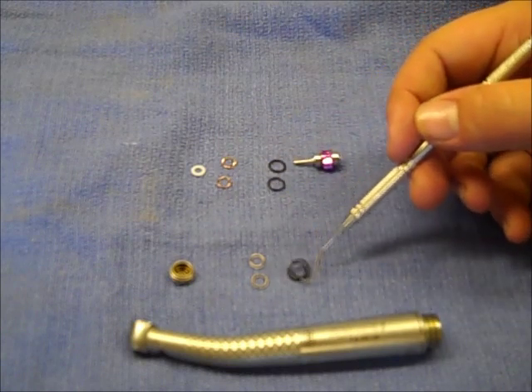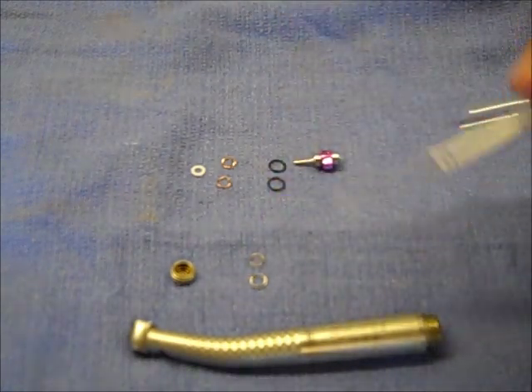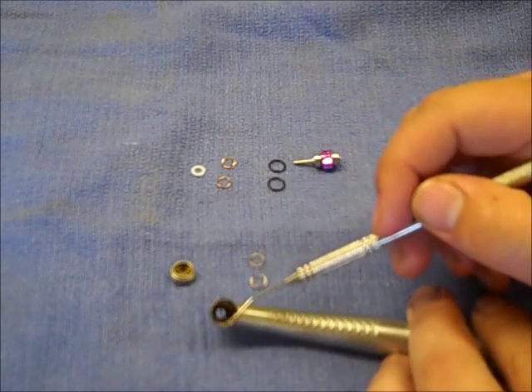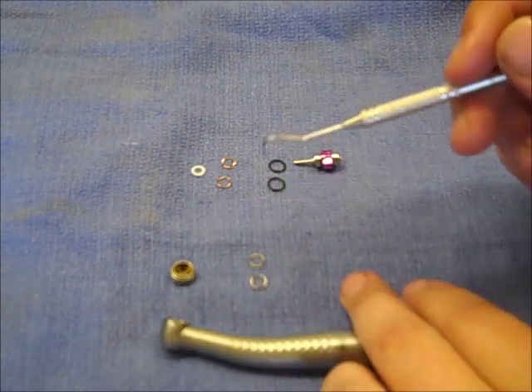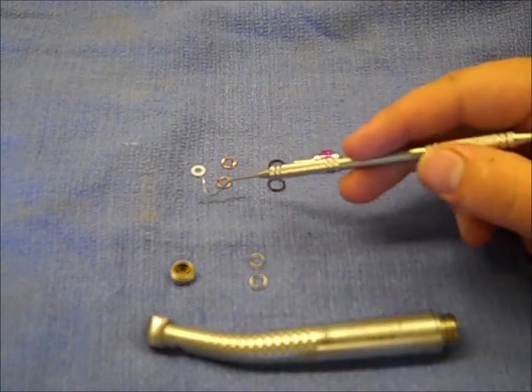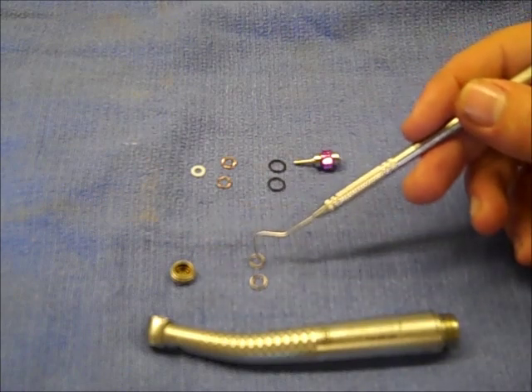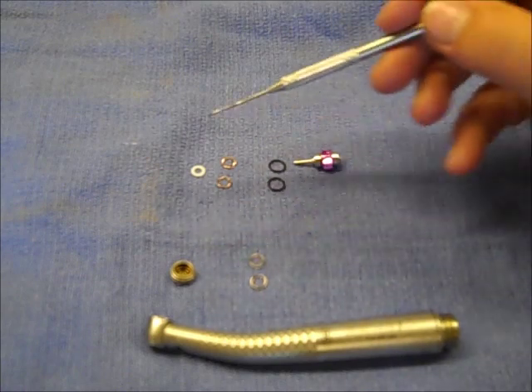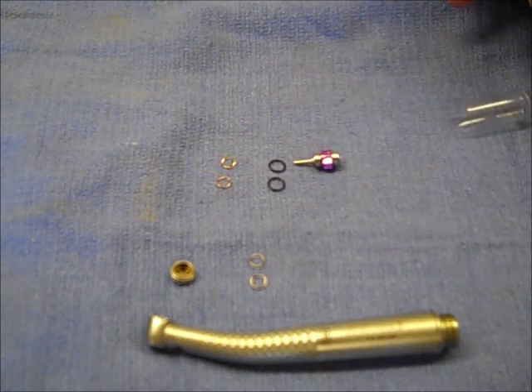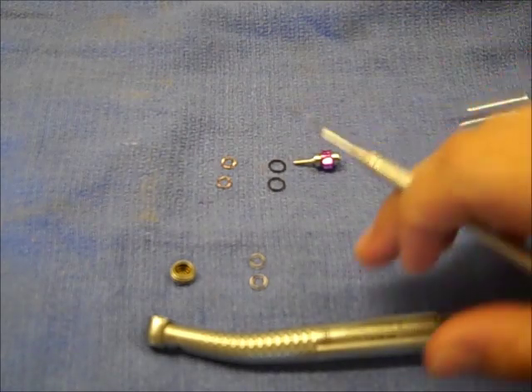The old O-rings that came out of the handpiece you can set aside — just throw them away. One comes out of a groove in the end cap, one comes out of a groove in the head of the handpiece. This particular handpiece is a good example of how the white Teflon washer is sometimes there — this one did not have it, it had two spring washers. We cleaned those up and we're going to reuse those. Since there was no Teflon washer, you can set that aside, no need to use it.